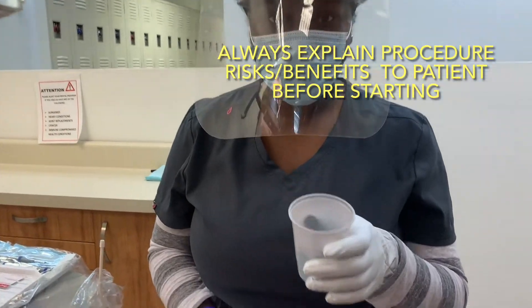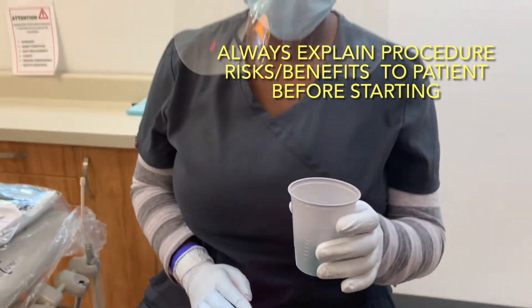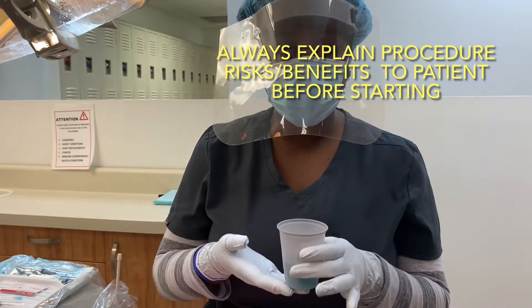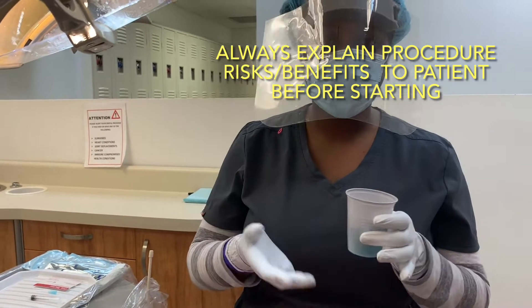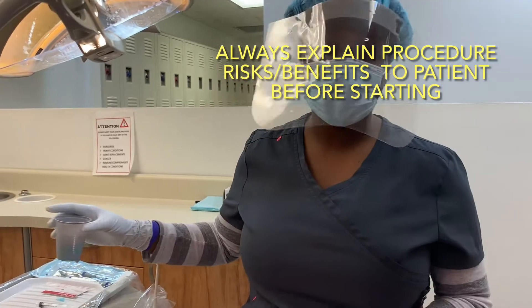To put my therapeutic agent, which is chlorhexidine — for video purposes I use Listerine — but in real life we use chlorhexidine or iodine.